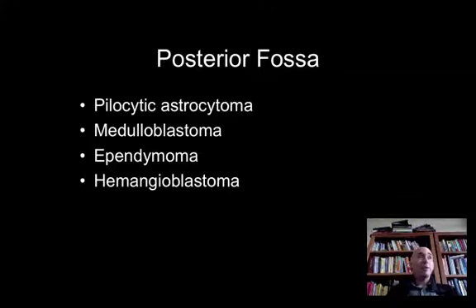Now, hemangioblastoma ordinarily presents in older adults, middle and older ages, rather than in a 19-year-old. So it's easy to understand how we might jump over this. Without the history of von Hippel-Lindau in the background of this patient, it becomes a much more difficult intraoperative diagnosis.